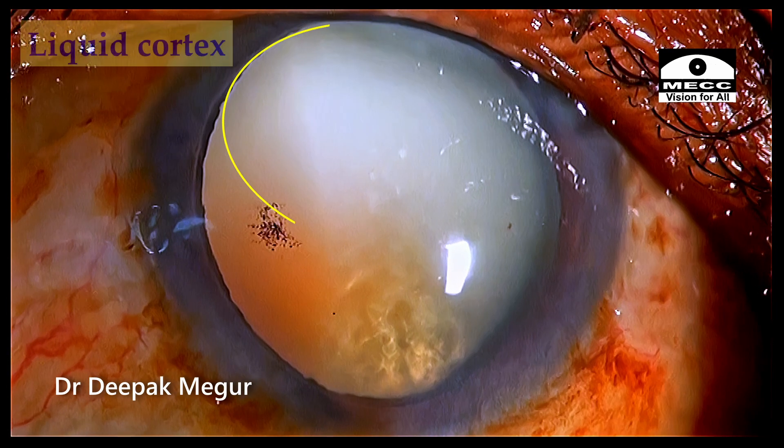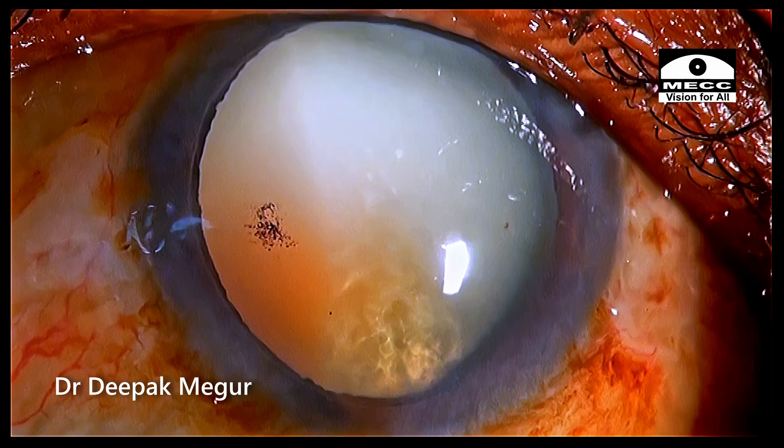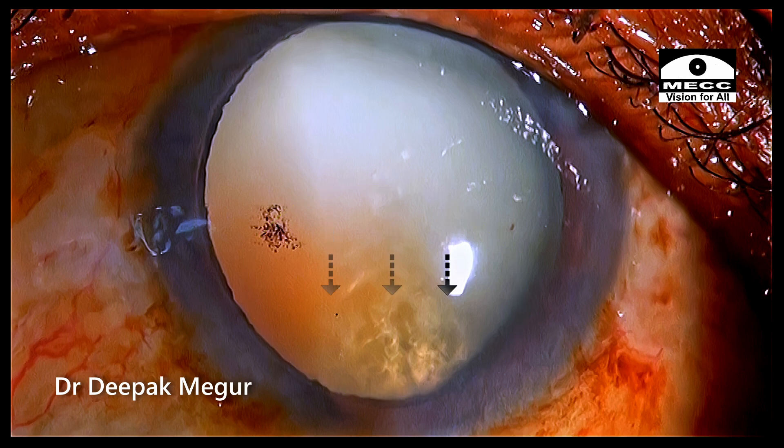We can see the liquid cortex occupying the more superior portion of the bag while the dense nucleus is occupying the lower half of the bag, primarily because of gravity — it has just sunk down.